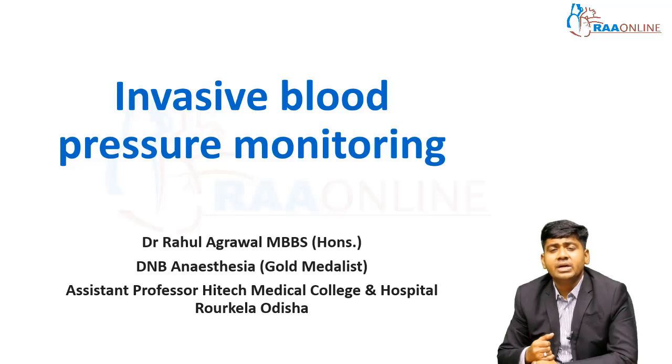because there is a very beat to beat variation in the blood pressure, we have to focus on invasive blood pressure monitoring when we are doing complicated cases like cardiac surgery cases, thoracic cases or neurosurgical cases, or also to aspirate ABGs. We have to put an arterial line like that.